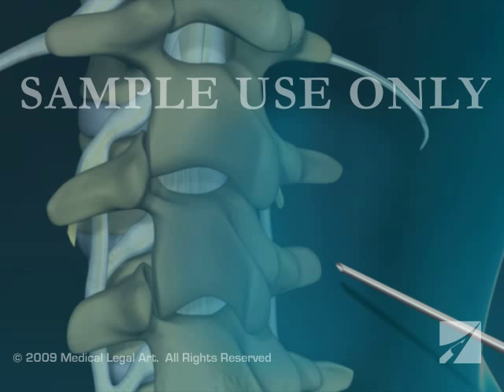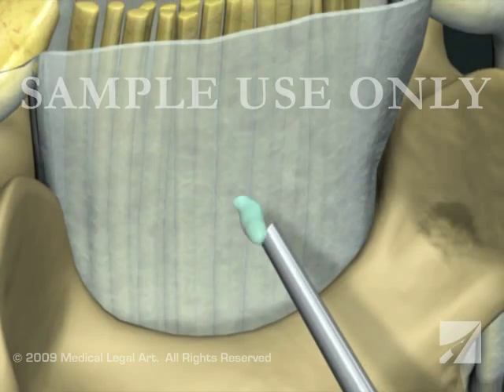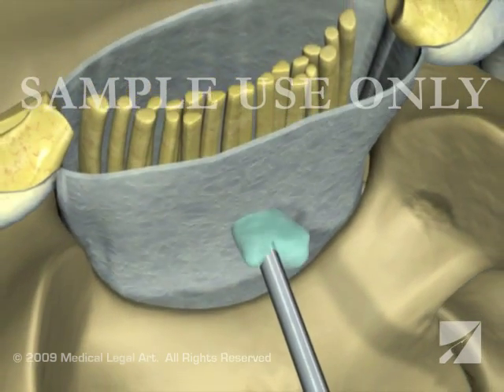The anesthetist will pass a needle through your skin between the vertebral bones. With epidural anesthesia, the needle does not penetrate the dura and medication is deposited just outside of the sac of fluid that surrounds your spinal cord.